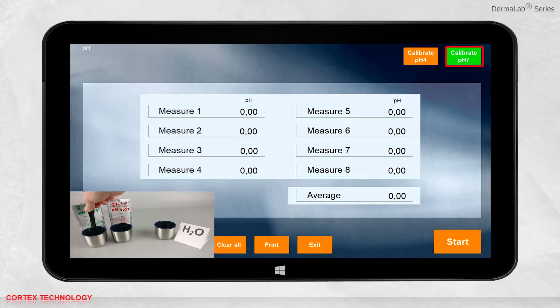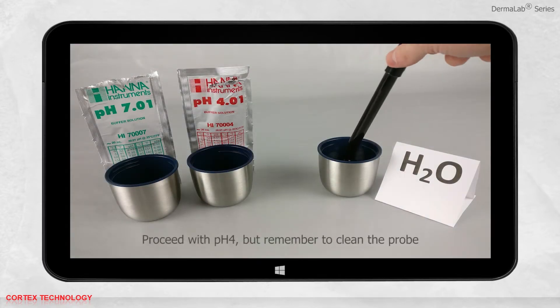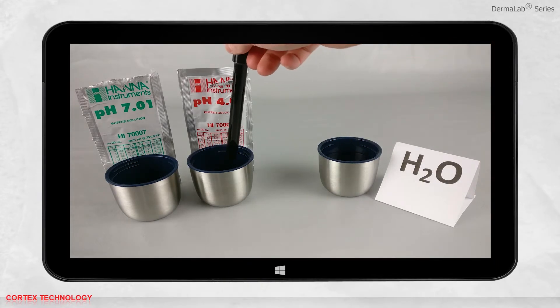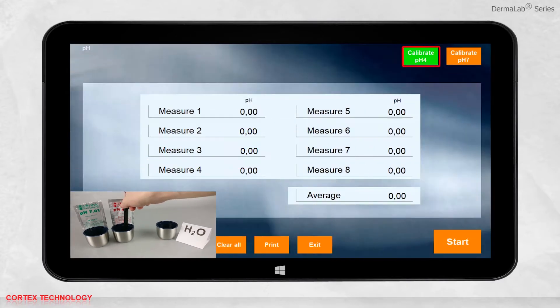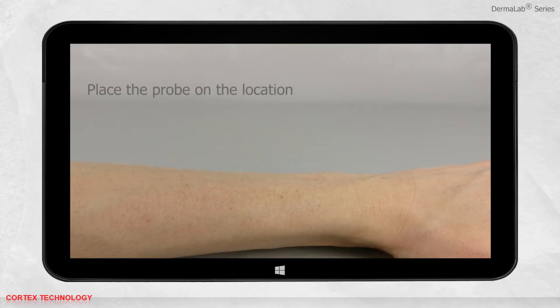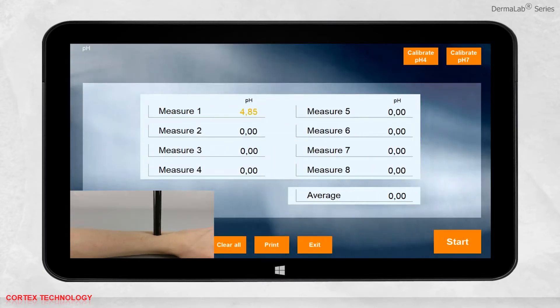The button will change color to green while the calibration is being performed. Once the calibration is complete, the color will change back to orange. You can now proceed to the pH 4 calibration — remember to clean the probe first. Put the probe in the pH 4 solution and hold it until the calibration is complete. You are now ready to perform a measurement: place the probe where the measurement should be performed and press start.